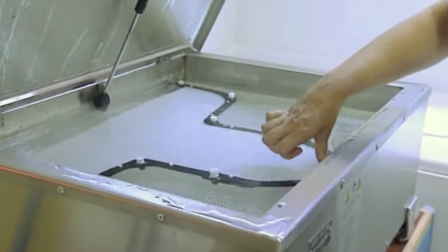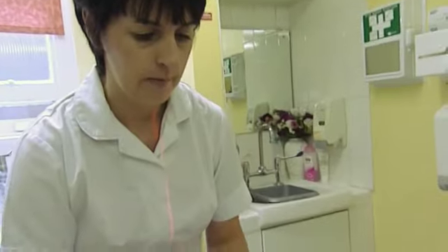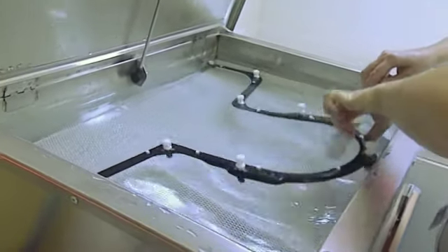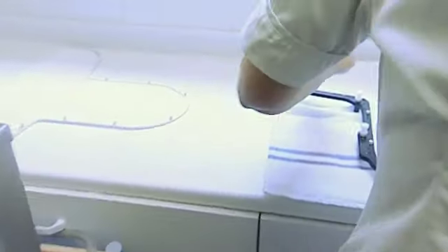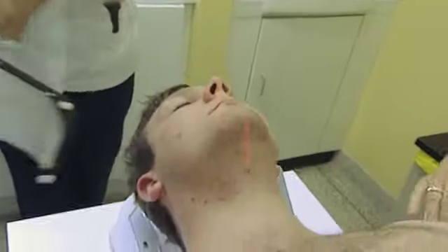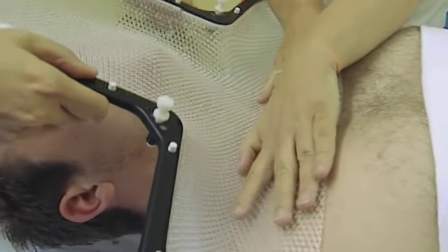Into the hot water bath. Because we're treating you around your neck area, you just need to raise your chin up. We're going to take a small measurement there just to make sure you are in the correct position. I can see the Orfit is ready. I'm coming over — if you'd like to close your eyes. It's a little bit warm coming across your chest area. Breathe normally for me.